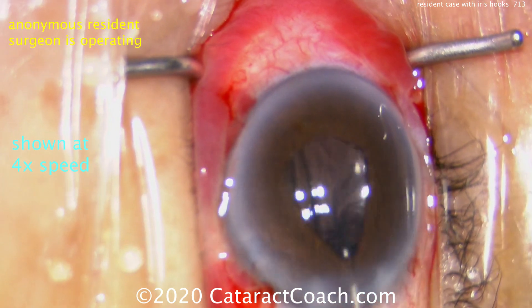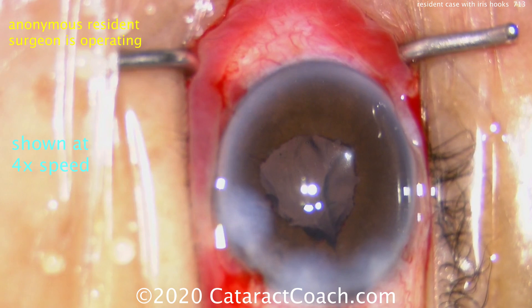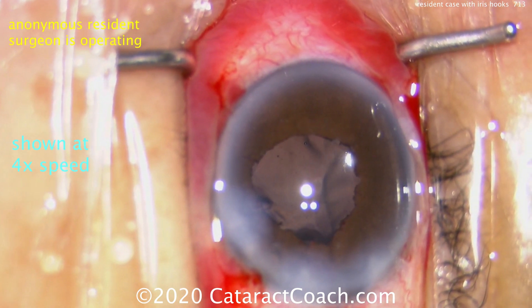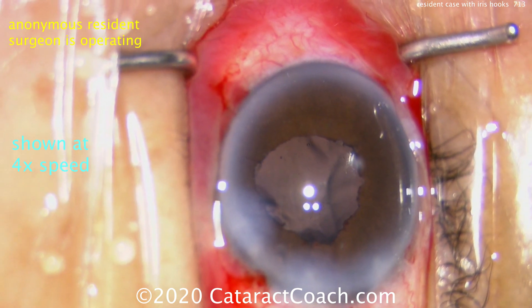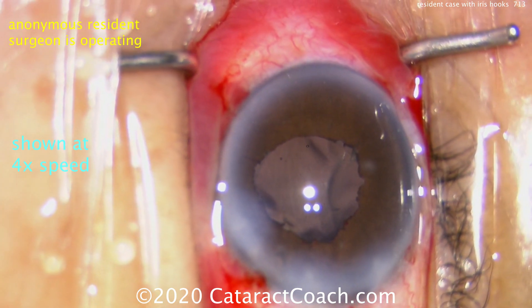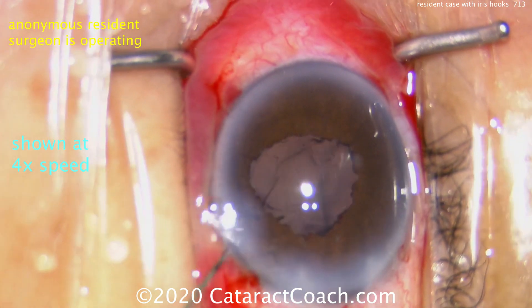You saw the releasing of pressure there, flattening out the anterior chamber to prevent iris prolapse, and also loosening the speculum. Now hydrate and seal the incisions, then go back and inflate the eye to normal anterior chamber depth and physiologic pressure. Nice case — thank you for submitting it, I sincerely appreciate it.